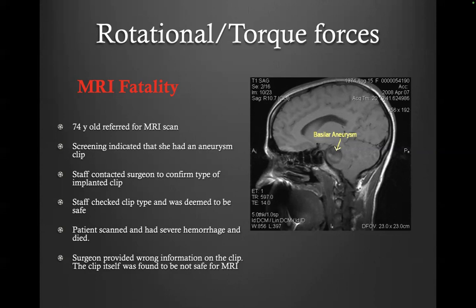If it's not a safe metal, even if it doesn't fly out of your head, it will rotate and cause damage to the brain. The surgeon provided wrong information on the clip, and the clip itself was found to be not safe for MRI. So these are really bad.